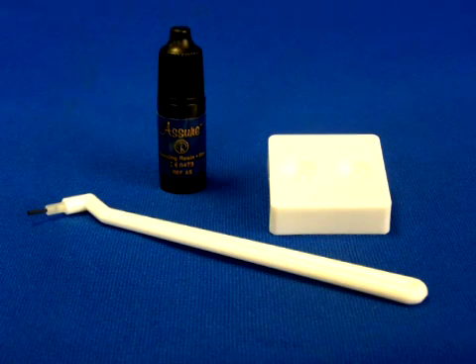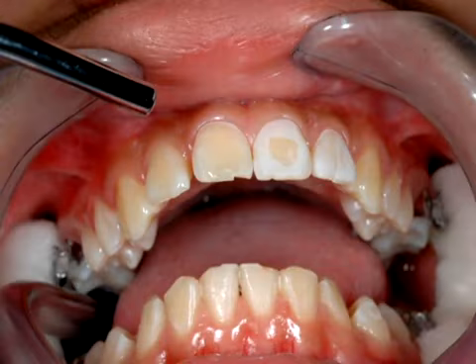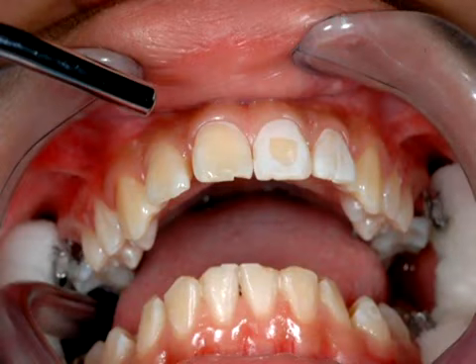Application of the Assure. Dispense a drop of the Assure into a mixing well. Pick it up with a brush or sponge pellet and apply one coat per tooth. Stroke over it several times to make sure we have good coverage and penetration. Lightly dry for a couple seconds, not to thin out the Assure, but to evaporate the ethanol, which is the solvent that carries the chemicals to the tooth.